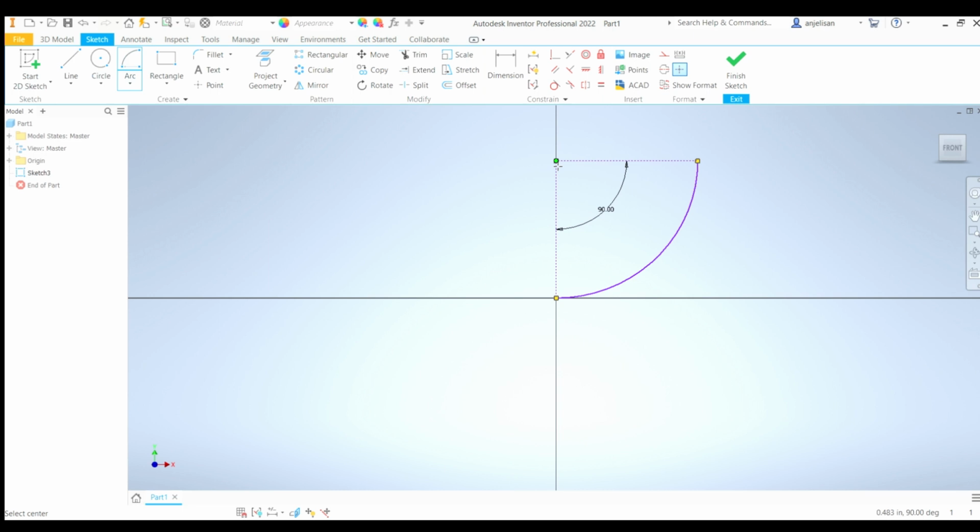Now we're going to make our second arc. So again, click on the first point that you made. Make sure it's directly on it with the green dot. Go down and don't hit the origin this time. Be a little more vertically up, or just up, yeah. So just click somewhere, and then again type in 90 degrees.